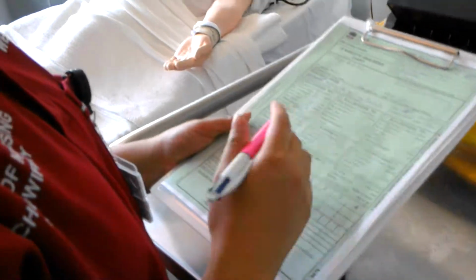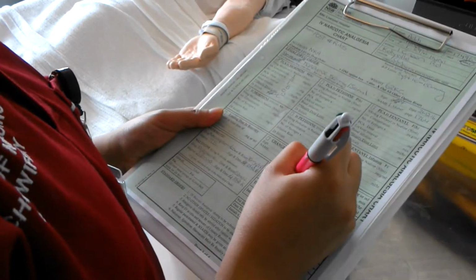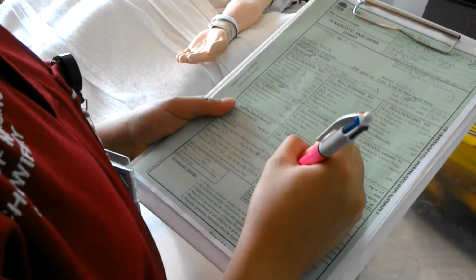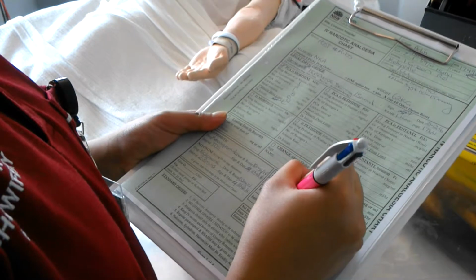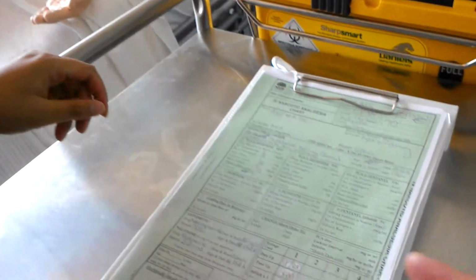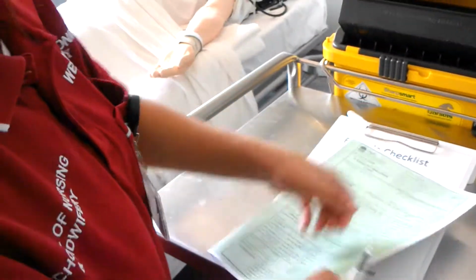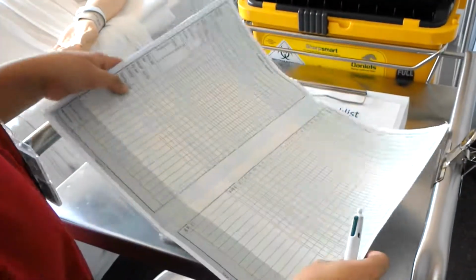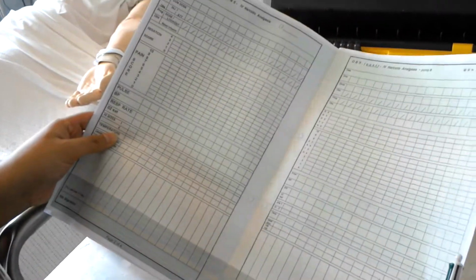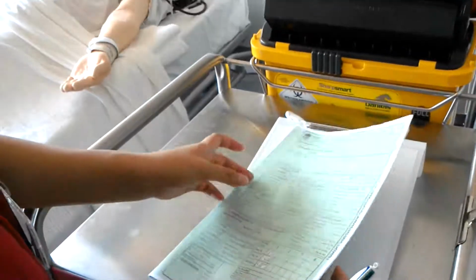Okay, so what I'll do is I'll just make sure that everything is signed and documented as well. So the date that I put up is when I prepared the medication, which is on the 18th of March. That's when I did the video also. The time up was around 2 o'clock. I'll just write my initials. And second nurse, can you please sign this with me as well? Okay. So my documentation's all done. I know that every time I do obs, I can list everything here. So when I come back in 15 minutes, I'll be writing all of the observations here also when I come back for my patient.